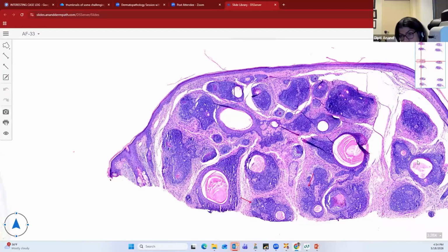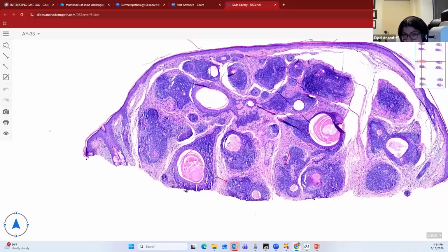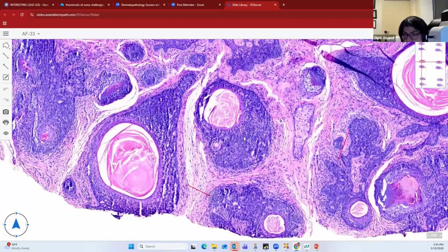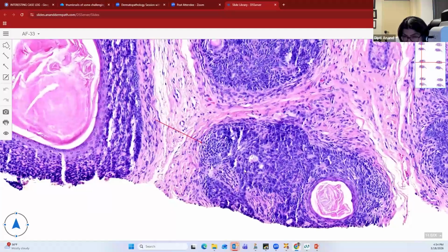And the tumor consists of scattered horn cysts, as you can see over here, and all these immature follicular islands, which have very prominent structures known as the papillary mesenchymal body. So what is a papillary mesenchymal body? Papillary mesenchymal body is condensed mesenchymal stroma, which is grabbed by this claw-like extension of the follicular epithelium. So it looks like a claw of the follicle is grabbing the stroma. That's your papillary mesenchymal body. Does everybody see that over here? So that's your papillary mesenchymal body.